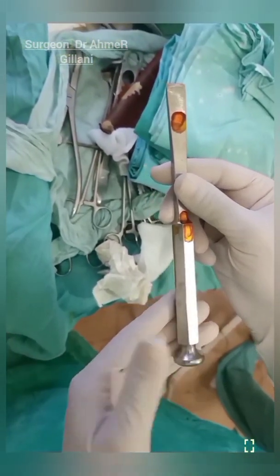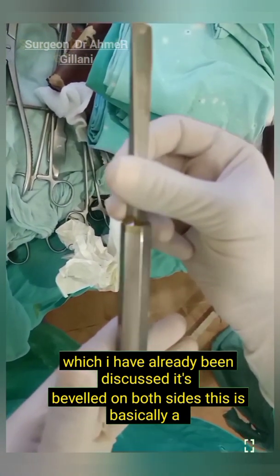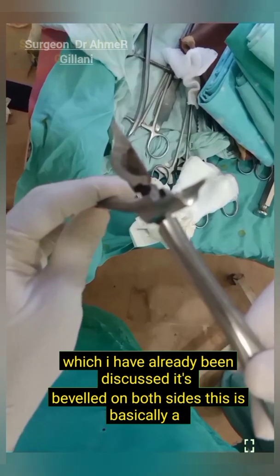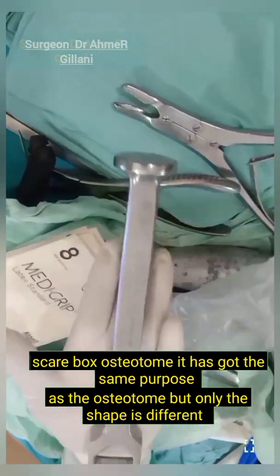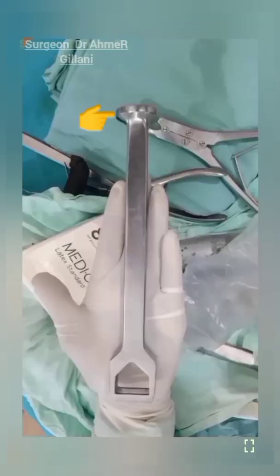Once again you are seeing the osteotome, which I have already discussed. It is beveled on both sides. This is basically a square box osteotome — it has the same purpose as the osteotome, but only the shape is different.